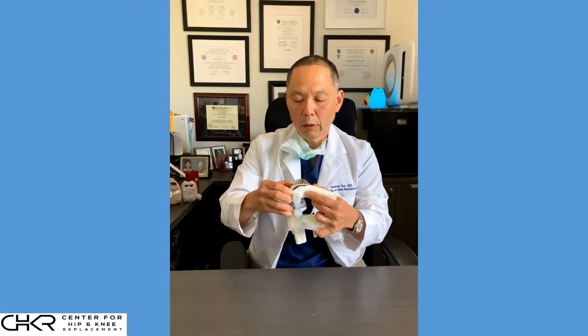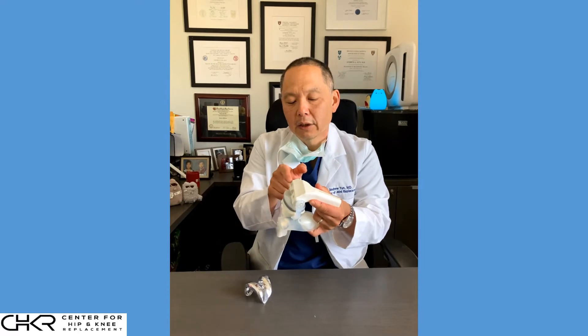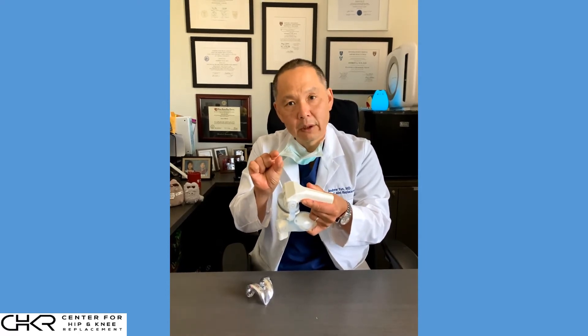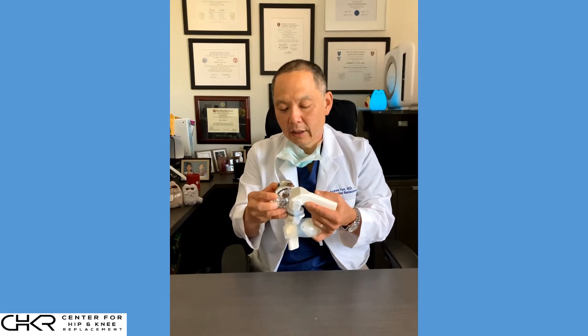So how do we do the knee replacement? We have the femur — this is the natural shape of the femur, which we know because we've done CT modeling prior to surgery. What we do is make cuts to the surface of the bone; each of these cuts is a few millimeters thick. We make cuts to the end of the femur that reproduce the inner shape of the implant, and then we insert that.